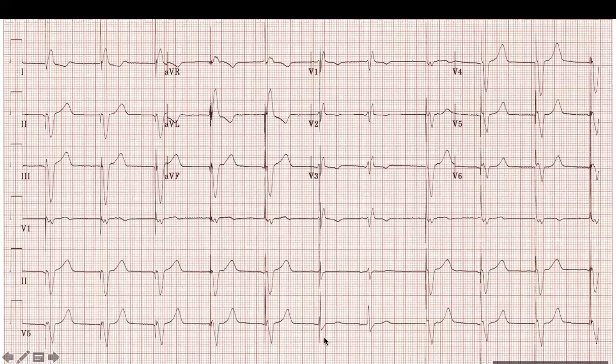The second pacemaker function is sensing. So how would you assess the sensing here? Ventricular. Okay, so if you sense the ventricle, what are you going to do? How does the pacemaker behave when you sense the ventricle? Inhibit. Exactly, so it's going to inhibit the pacing. Do you see any evidence of that pacemaker function? No.